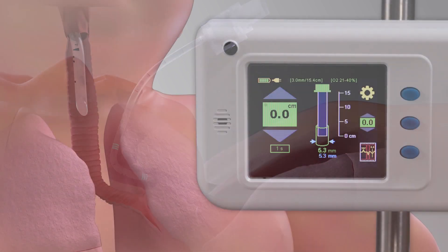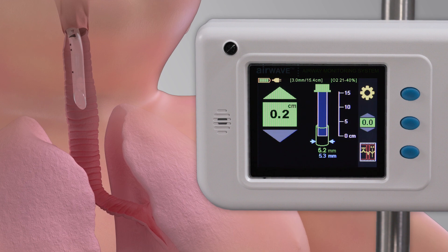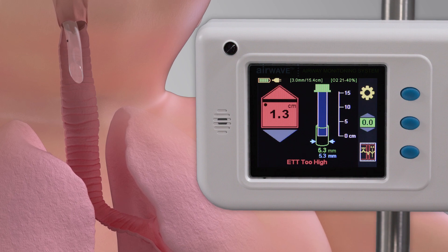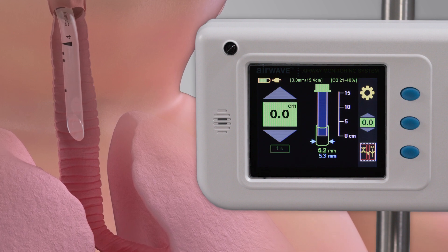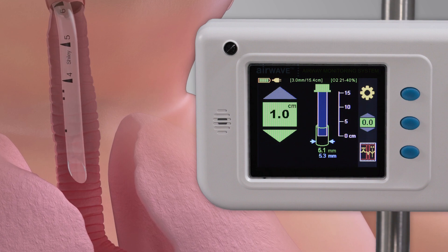The first continuous measure is movement and direction of the ETT tip. You will see upward movement from the set baseline location and an indication if the tube is too high. You will also see downward movement from the set baseline location, with an indication if the tube is too low.